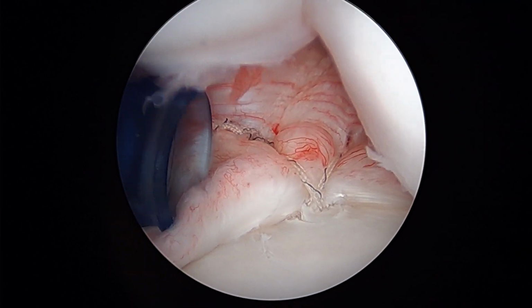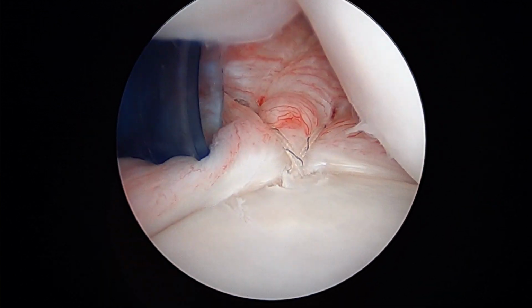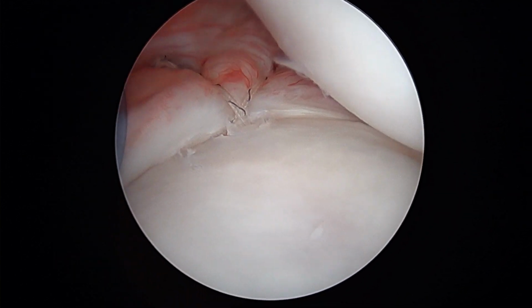Okay, so we've tied that figure 8 mattress stitch in the back, and you can see how that nicely tightens the posterior capsule and really already has done a lot to close down the capsular volume.